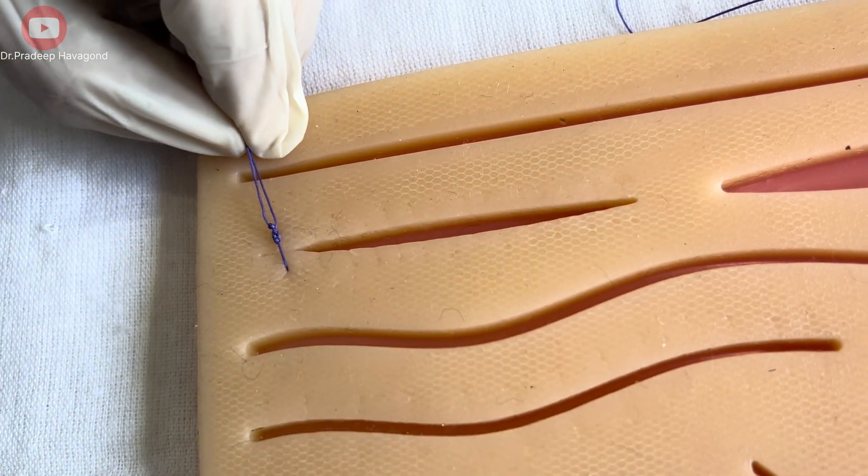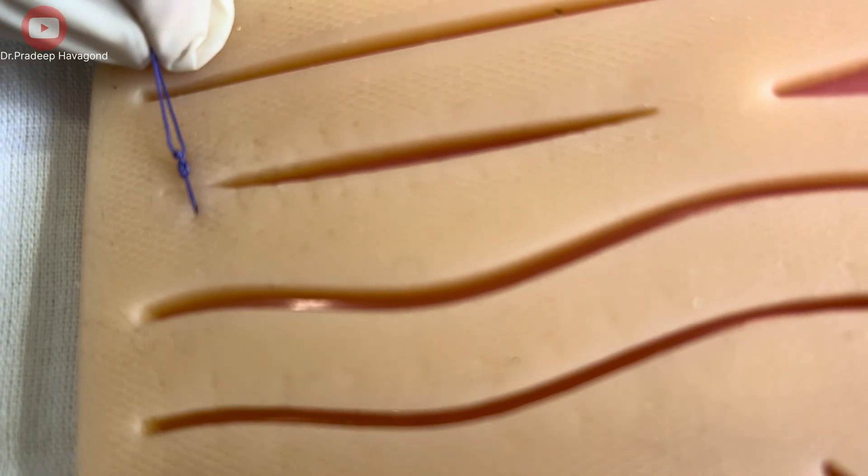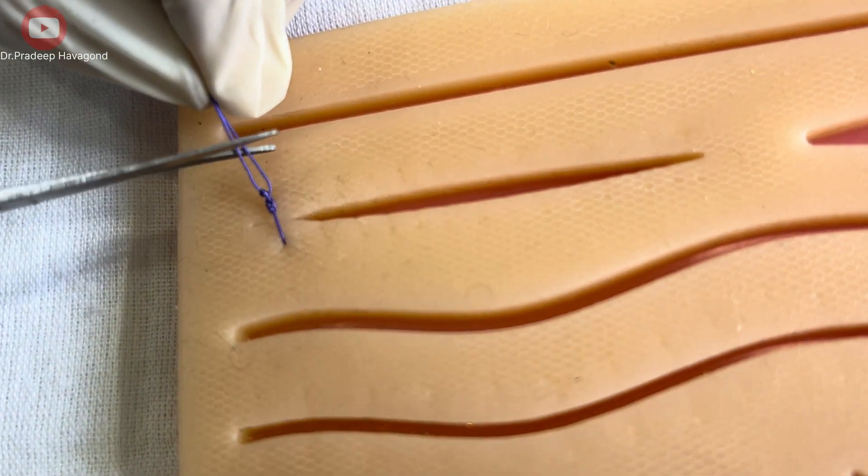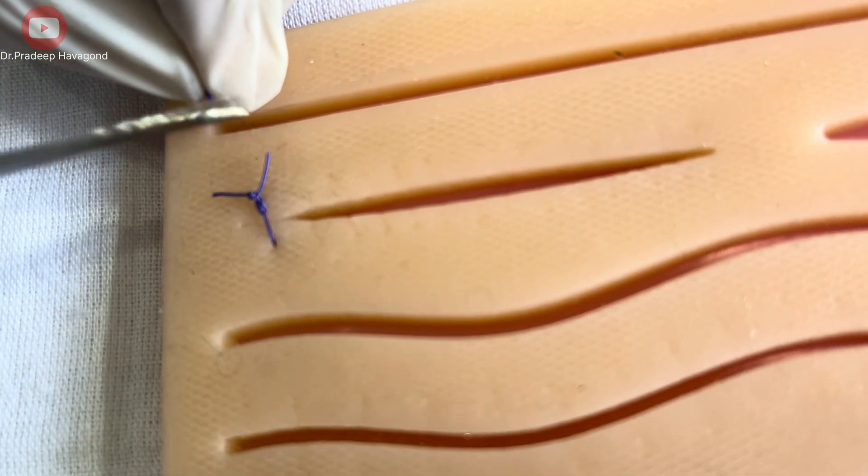Be sure to leave enough sutured tail to prevent untying, but not too much that it causes irritation or infection.